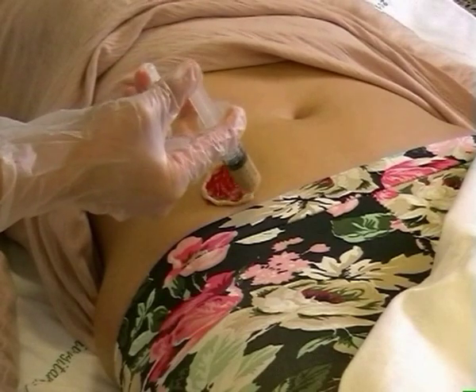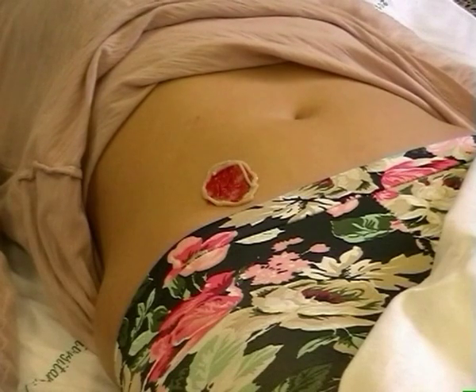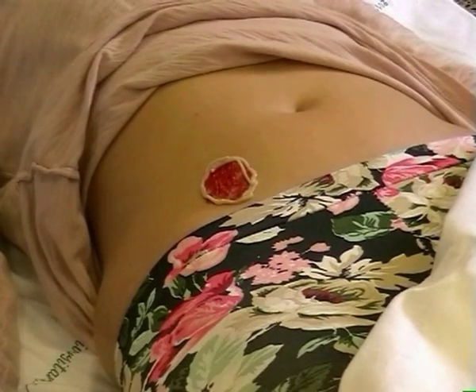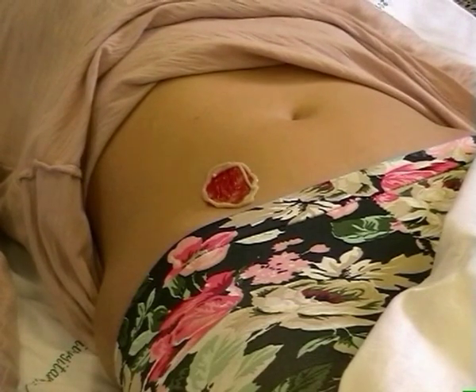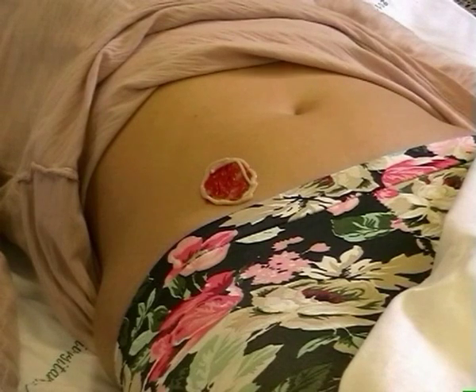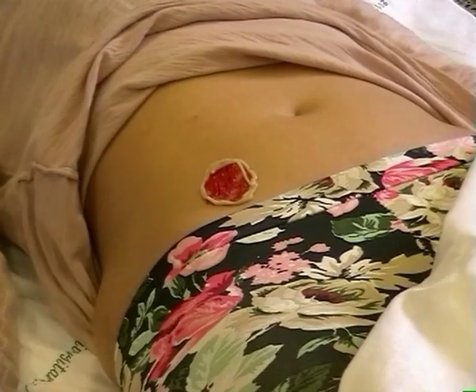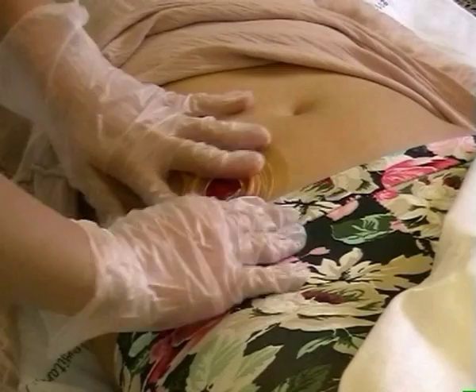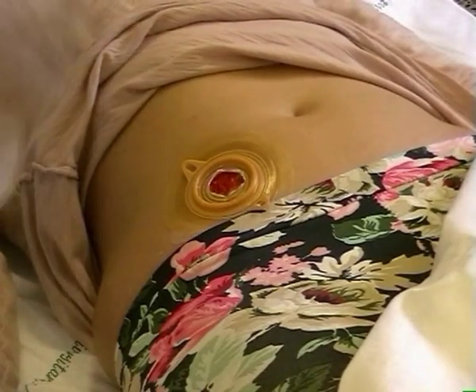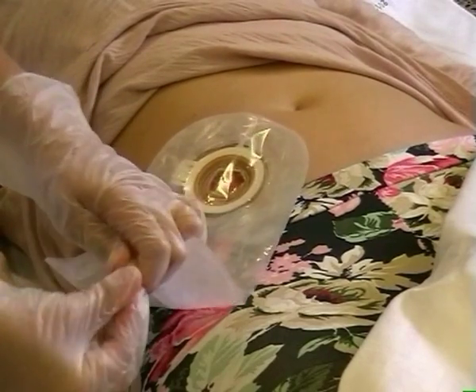Applica attorno allo stoma la pasta protettiva. Nel frattempo che la pasta si asciuga, l'infermiere taglia la placca della misura corretta e la modella tra le mani. Applica la placca alla cute facendola aderire bene, attacca la placca al sacchetto e ne verifica la chiusura. Ricopre il paziente.